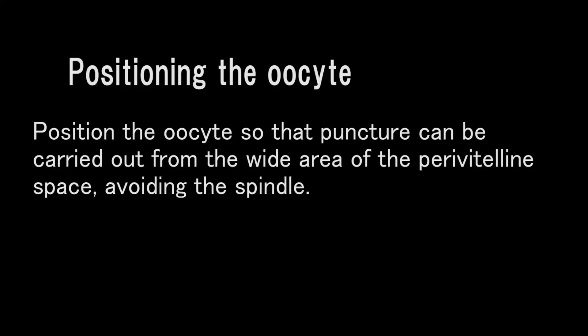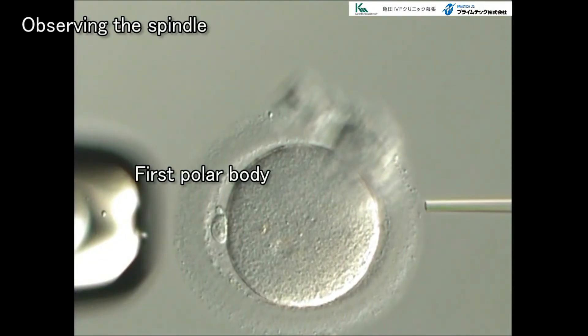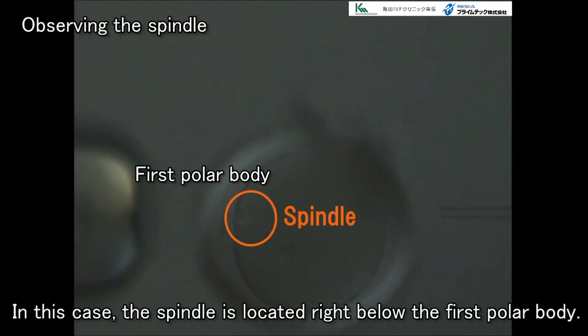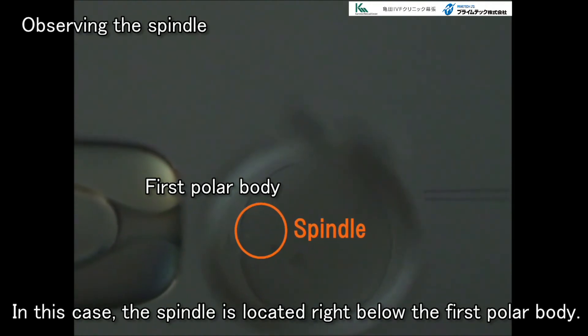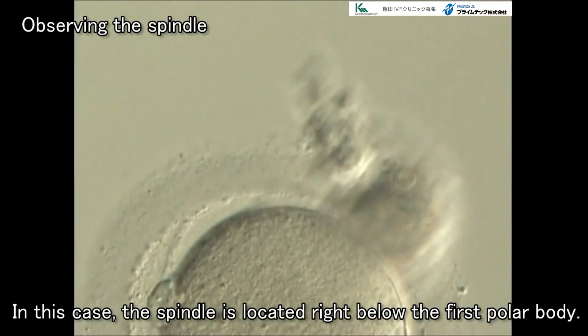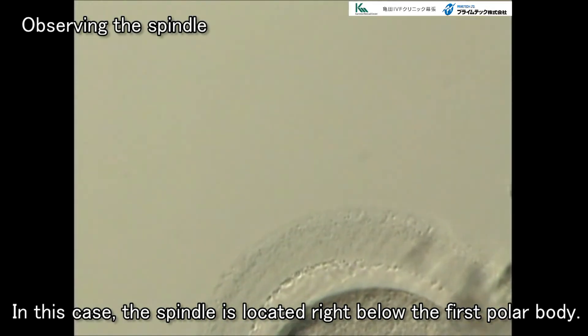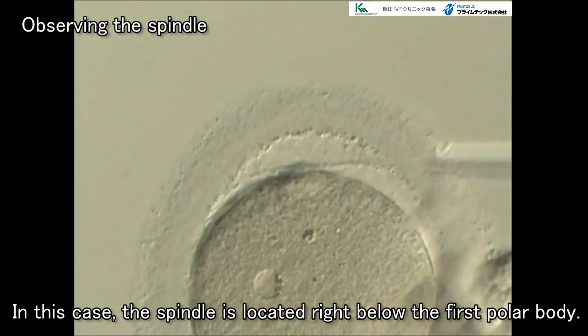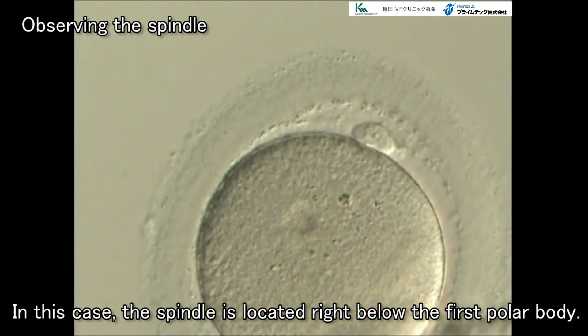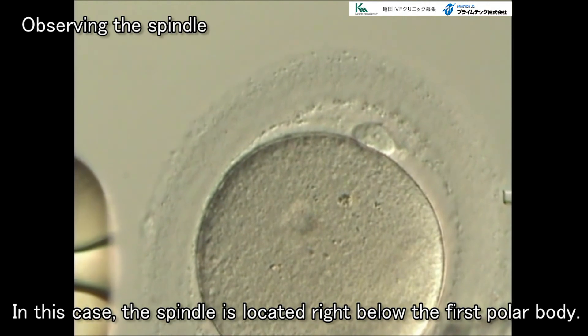We'll now explain about holding the oocyte. Adjust and maintain the direction of the oocyte so that puncture can be carried out from the wide area of the perivitelline space within the range in which the pipette will not travel over the spindle.